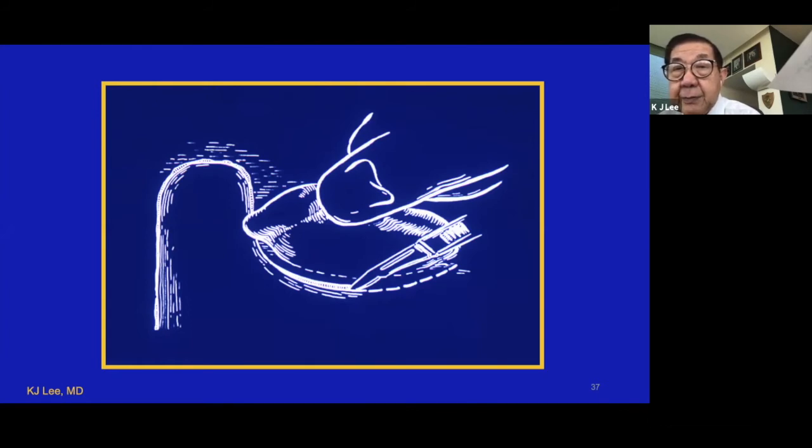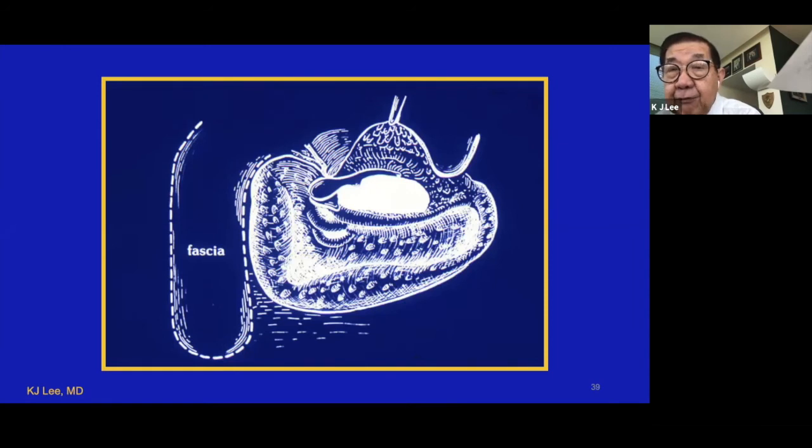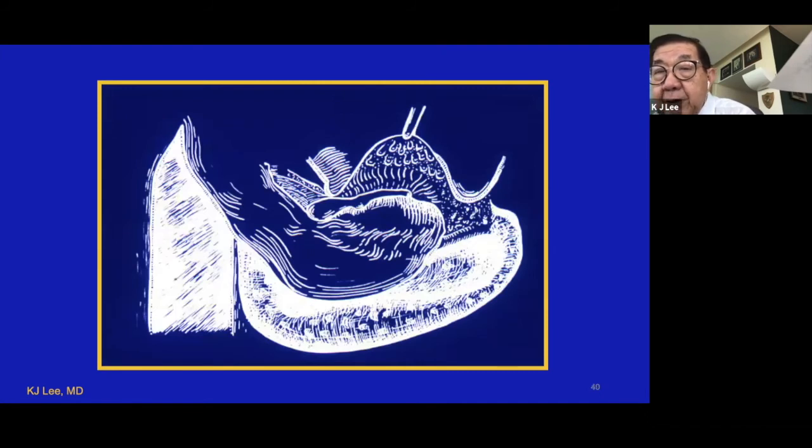Next. Almost like a craniotomy incision. So here you see the Van Hulst flap, and you see the Körner flap. Next. After he has finished the surgery, the mastoid tympanoplasty, he swings the fascia. He created a large piece of fascia. Next. To build the tympanic membrane and also to line the mastoid cavity. This is a canal wall down, obviously.